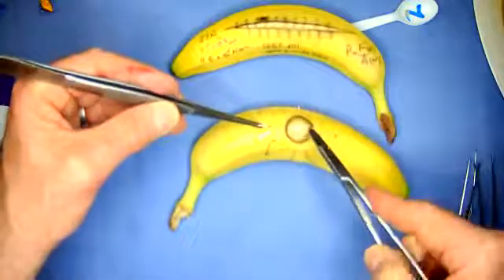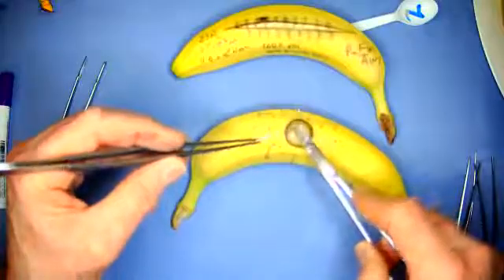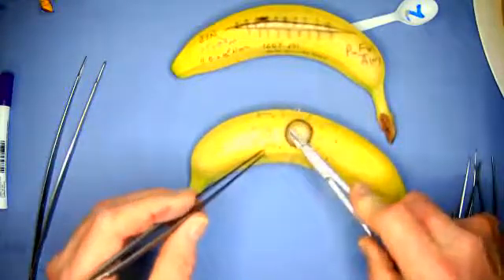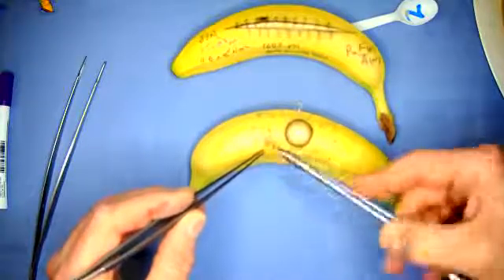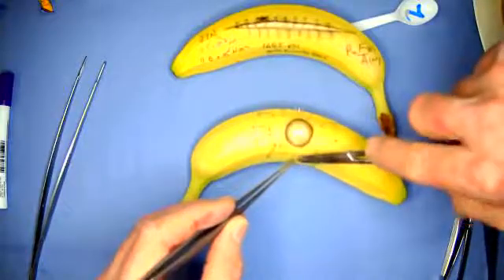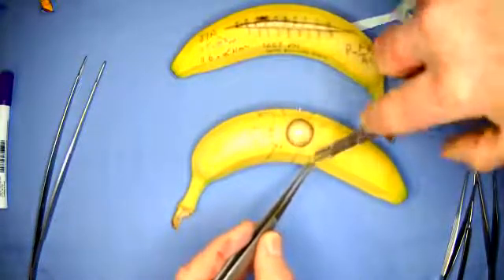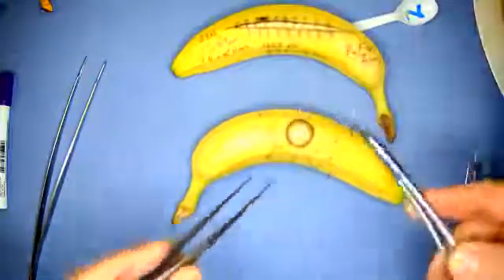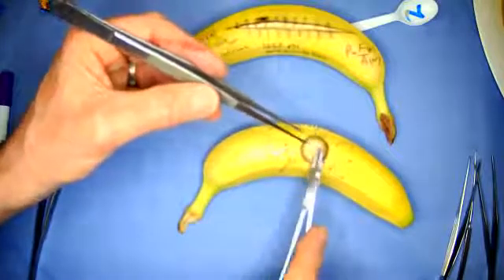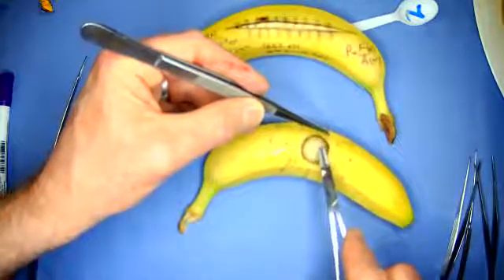Remember, that's where I came forehand and backhand. And again, all right. So I'm just focusing as I'm going round. Actually, I like practicing on these models because after a little while, you do find yourself getting into a rhythm, a sort of meditative state as you're going round and concentrating on doing that. Okay? I've covered the maneuvers with the needle previously, so I'm not going to describe them today, but I'm wanting to demonstrate that my forceps is not interfering, it is retracting.